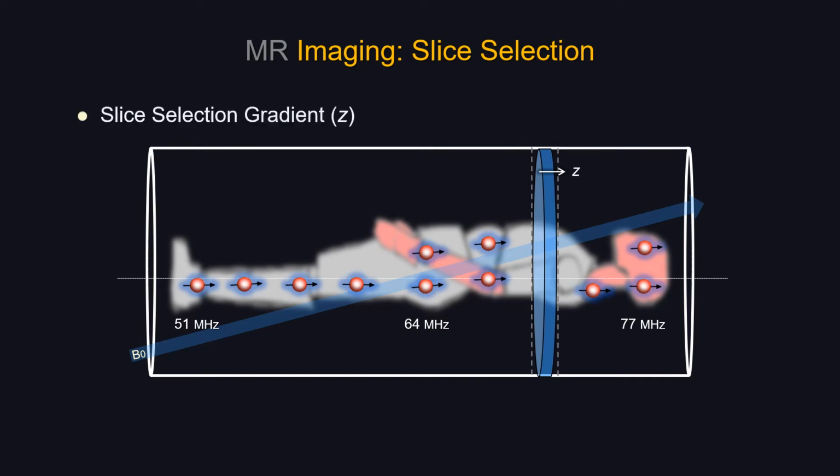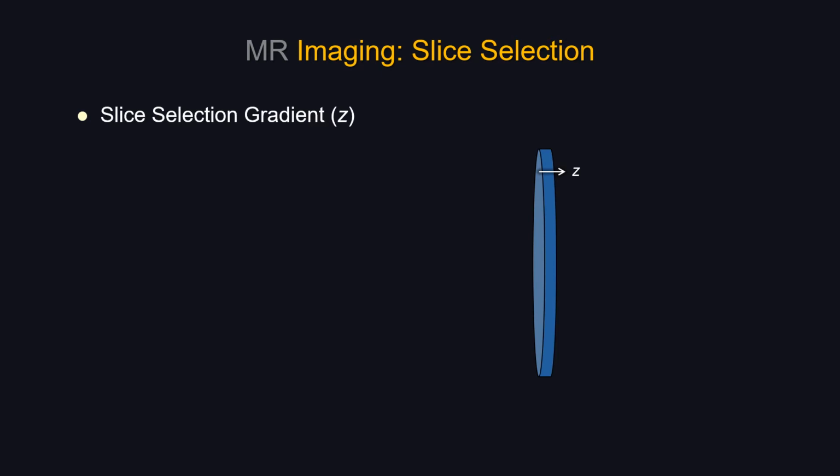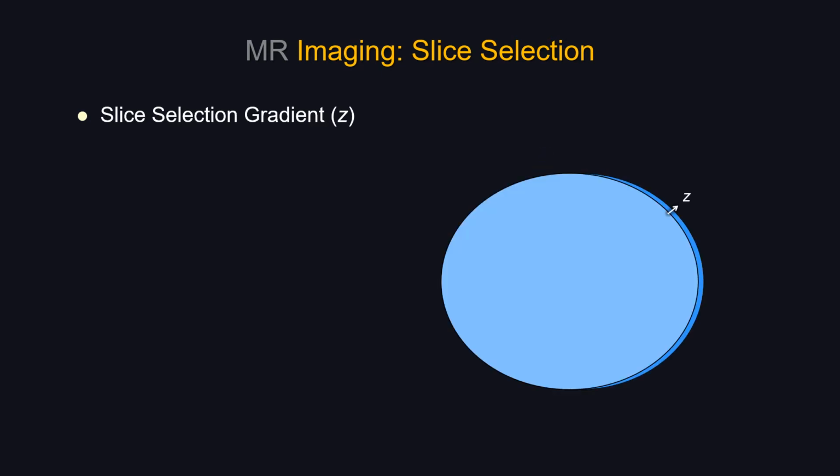Now you have the first step of localization. You have the slices that you wanted. All you get is a signal coming from the entire slice. You have no idea if the signal is coming from the top, the bottom, left, or right. What if, for example, you want to detect a lesion like this little terminator in the right upper quadrant? How do you do that?